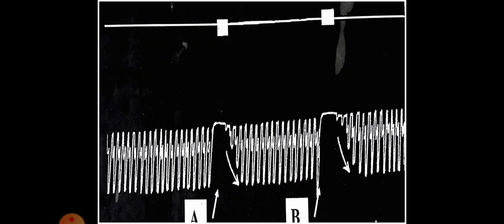So now what we do, you can see the normal activity of heart. Normal activity of heart has been written on by the lever on the drum, and this drum is moving. Okay, it is a moving drum. So at point A we stimulate the vagus nerve. When we stimulate the vagus nerve, you can see the heart stops in diastole.